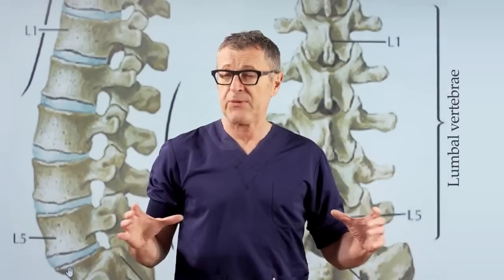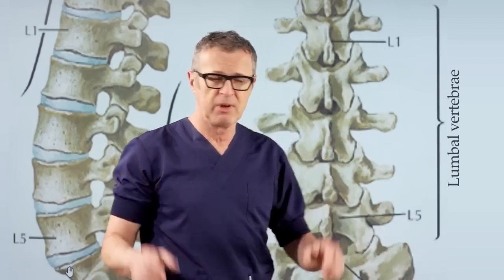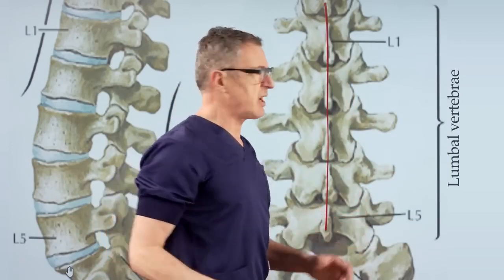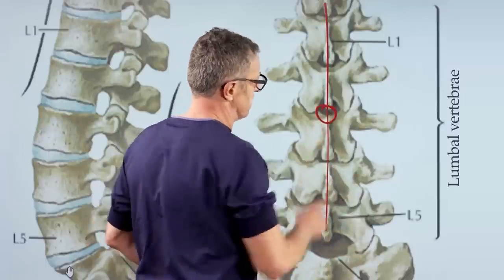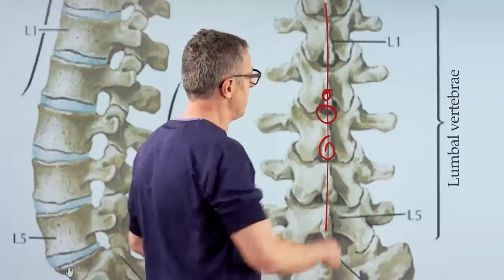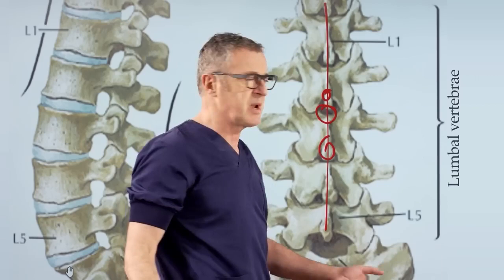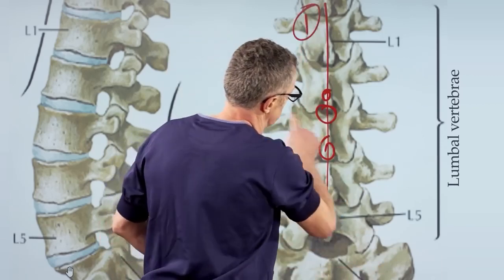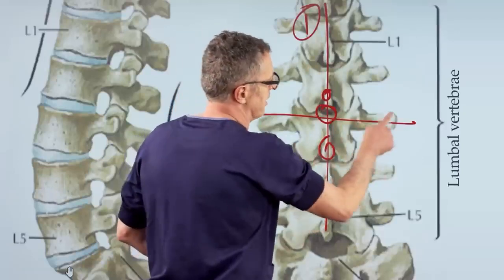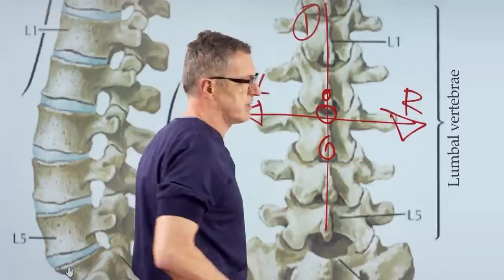When troubleshooting a difficult spinal or lumbar puncture, you must consider the 3-dimensional view. The first dimension is the vertical. Always ask yourself if your needle is inserted in the interspace or at one of the spinal processes, so that you can reinsert the needle vertically. The second dimension is the horizontal one. Am I in the midline or off midline? And if I'm off midline, am I off to the right or to the left?